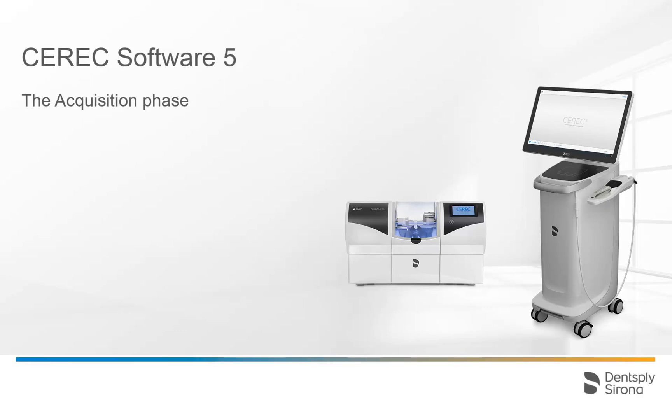Welcome to this video tutorial on the topic of the Acquisition Phase with the CEREC Software 5. In this tutorial, you will get to know the different image catalogs, including their functions, as well as the different functions in the Page Palette.